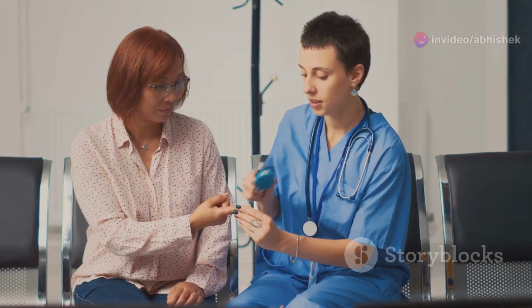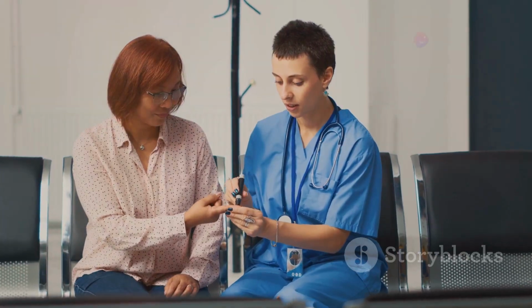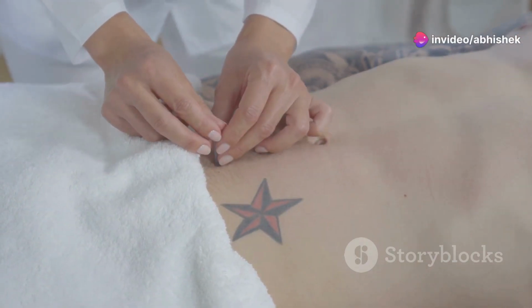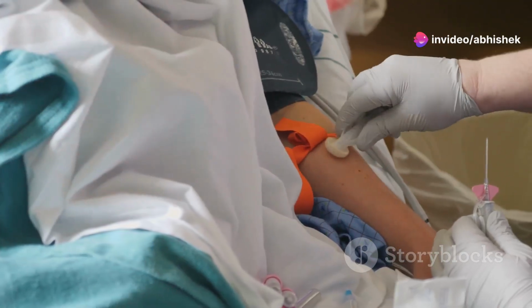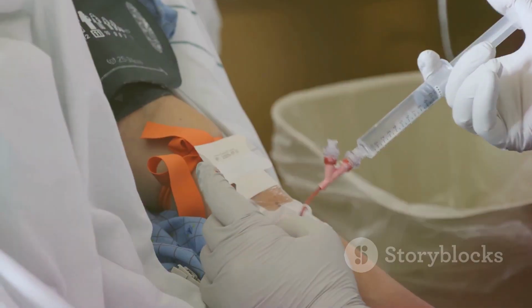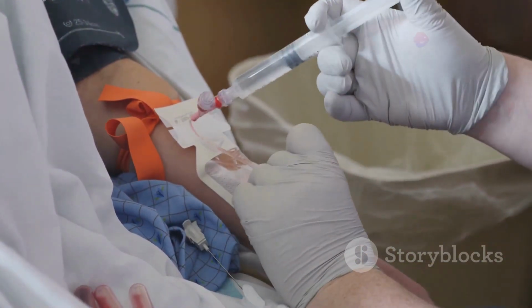SC injections deliver medication into the fatty tissue beneath the skin. Absorption is slower than IM injections. Common sites for SC injections include the abdomen, away from the navel, which provides easy access and good absorption; the outer thigh, another site for self-administration; and the upper arm, specifically the back of the arm, used for some medications and insulin.